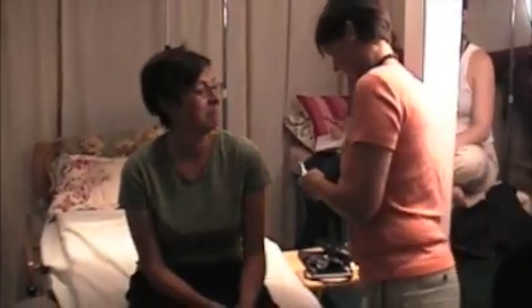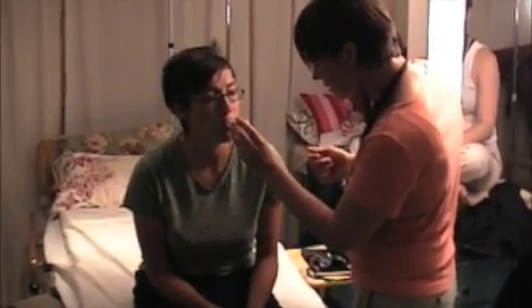So I've washed my hands and I'm doing a screening physical, and this is Birthing Way in 2008 in the spring. How are you doing? If you can put this under your tongue. Perfect.